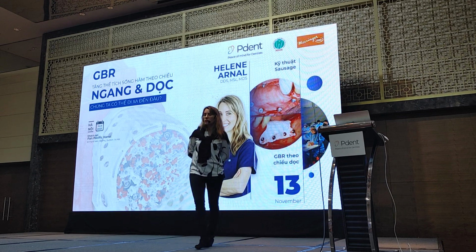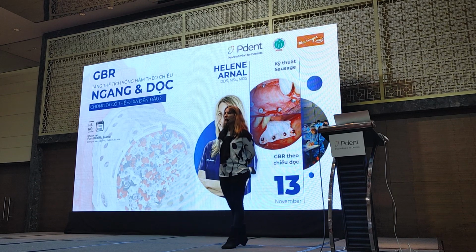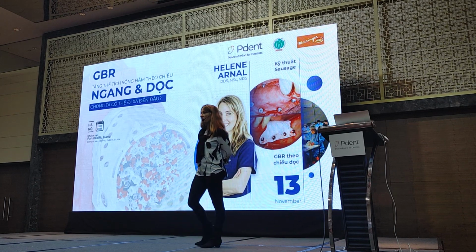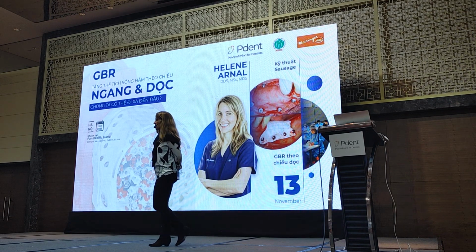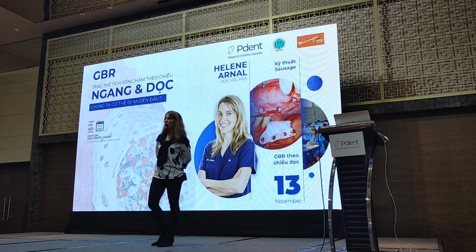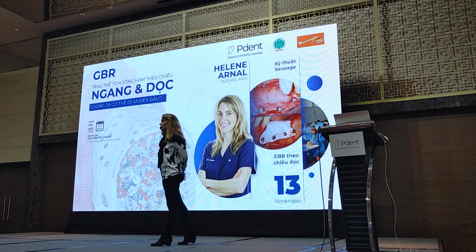So, to have no exposure, you have to be very careful and respectful with the flap, especially the lingual flap that is very easy to thin too much. And the flap closure without tension. It's very sensitive to the flap closure.